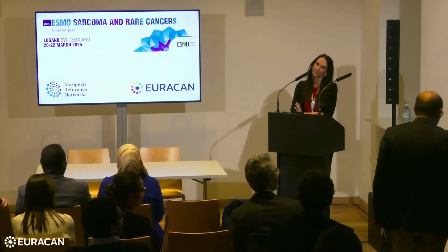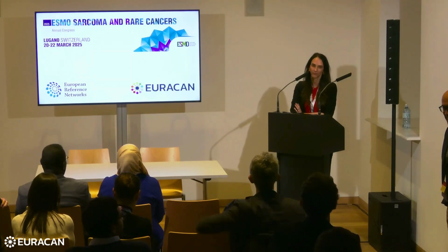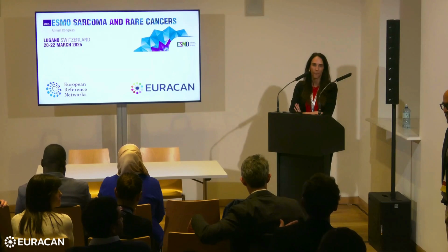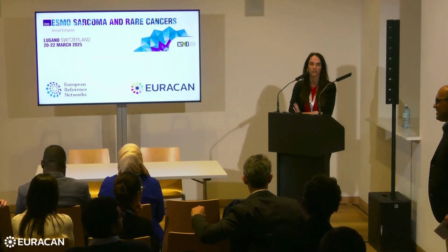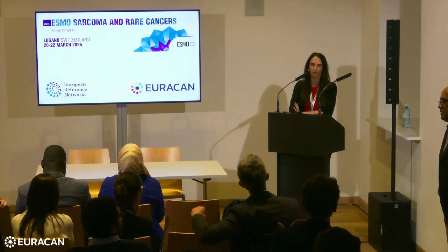The first case you presented was very tricky. I saw that the choline peak was related to cell membrane renewal and cell proliferation. So in this case, is the choline peak related to myelin remodeling or to proliferation of immune cells?